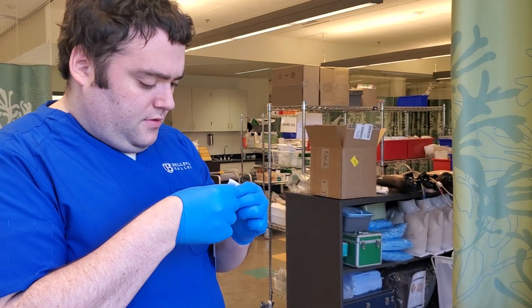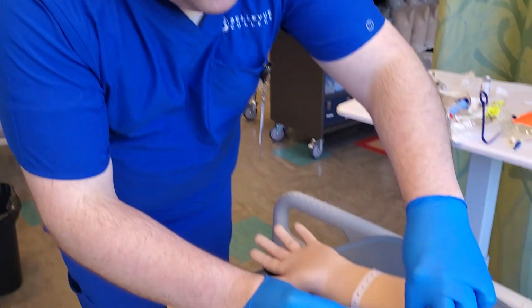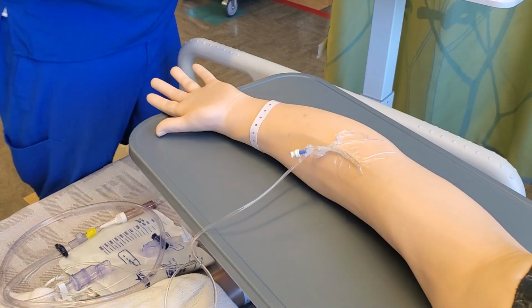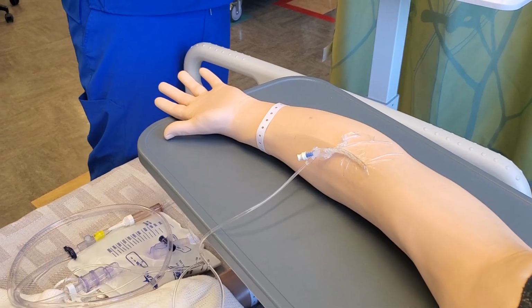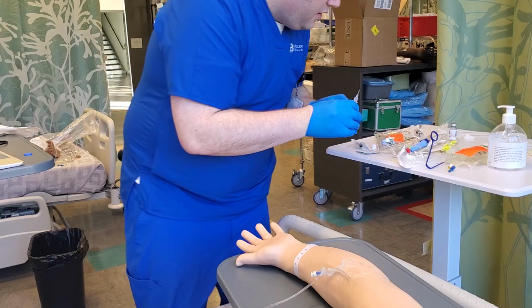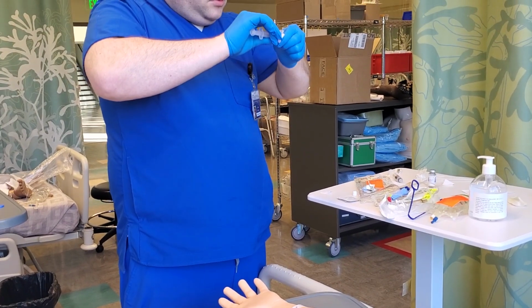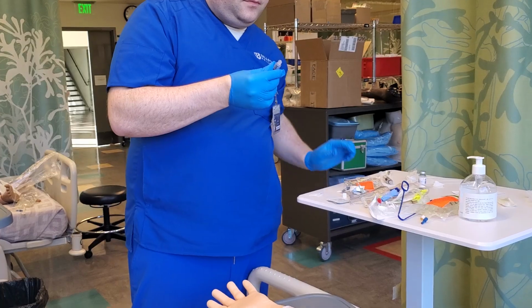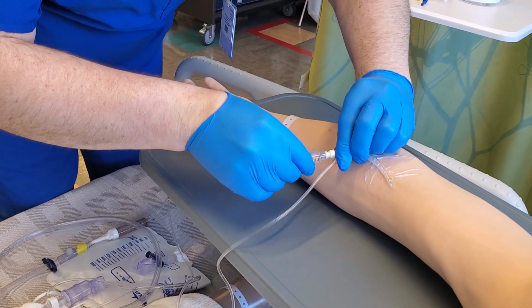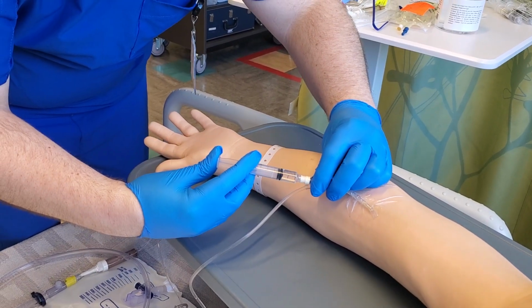Let's wipe this down again, seconds, and then we got the mid here. Let me go ahead, don't want to do that. Okay, so we're going to go ahead and then do this over 2 minutes.